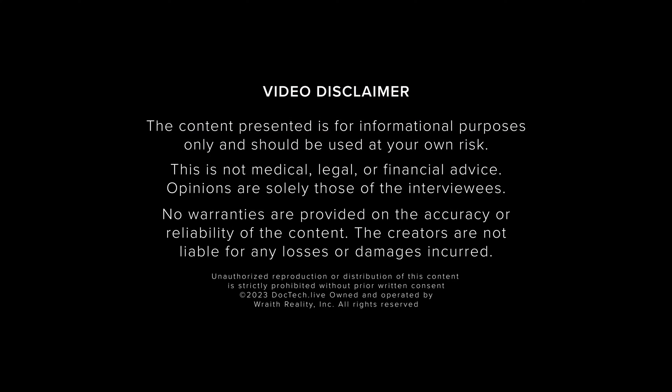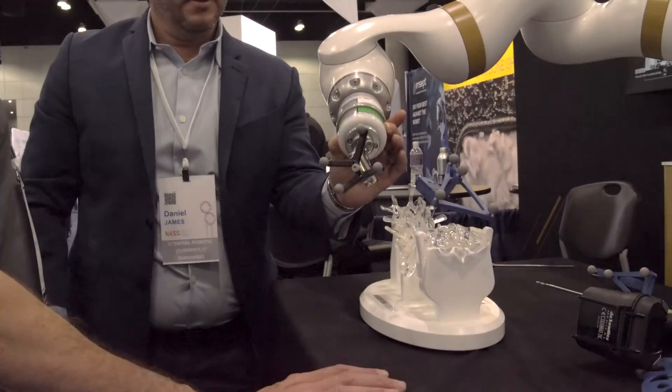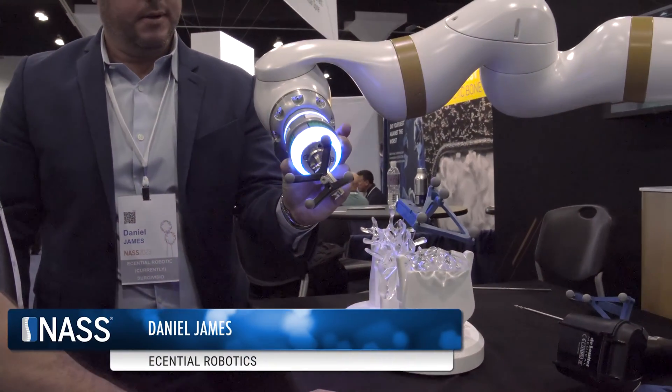Launch Sequence. And we have speed. I'm here with Danny. We're with eCential Robotics, and he's going to show us how cool this robot is.